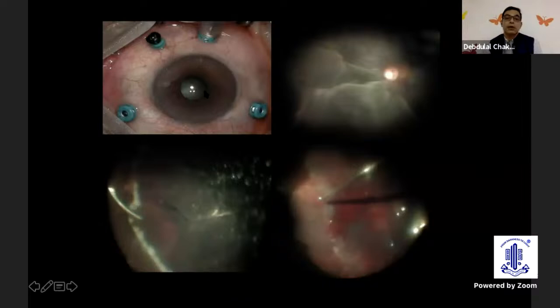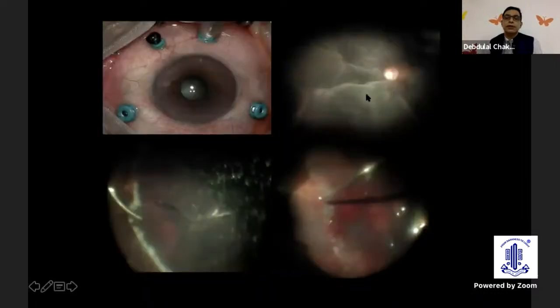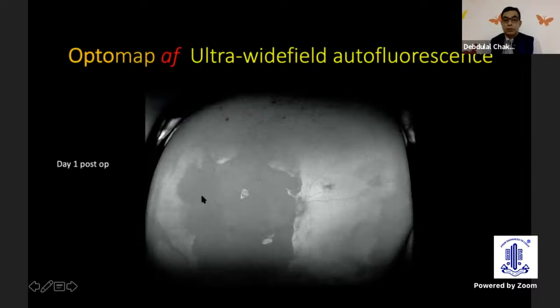This is the intraoperative capture of the pupillary size. And this is something that we did this Monday itself. And through this small pupil also, you can get a picture like this. So of course, we removed the subretinal blood through a temporal retinotomy, and we realized that there was a large RP rip. And then this is day one post-op. This is last Tuesday, we could capture this large RP rip that was possible to see with this ultra-widefield autofluorescence with the Optos. So this was on day one.